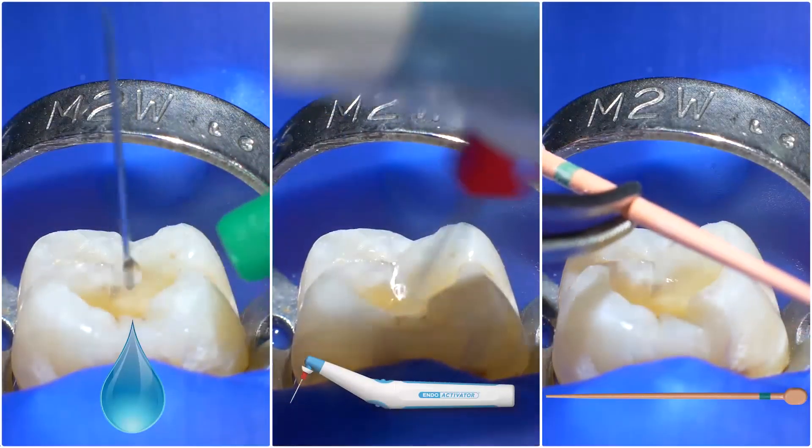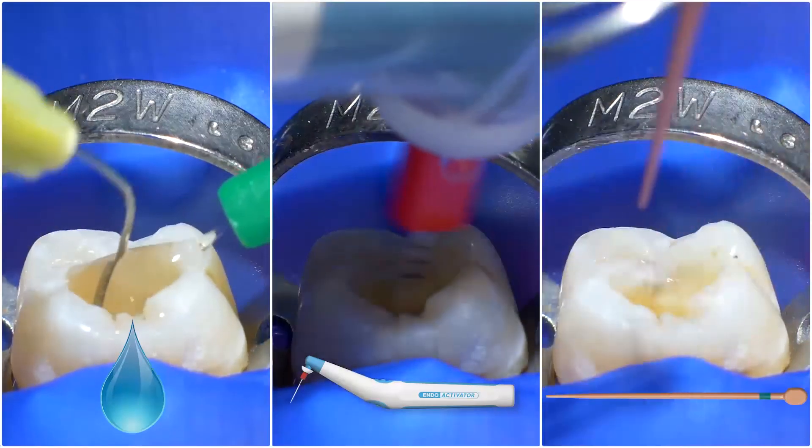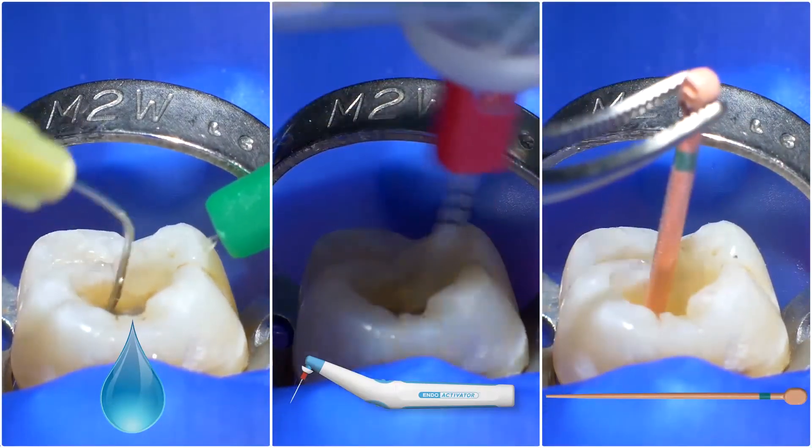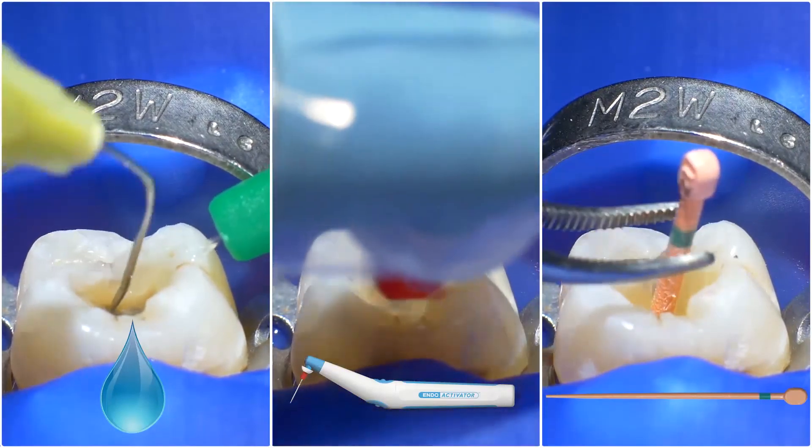In our second scenario, when all the clinical information points at a very large canal — for example, on a maxillary incisor — WaveOne Gold Medium or WaveOne Gold Large, which is a 45 with an initial 05 taper, might be used immediately after scouting the canal. A good disinfection protocol is a must, regardless of your final apical size. And the WaveOne Gold matching taper gutta-percha cone is the perfect complement to the work you've already done.